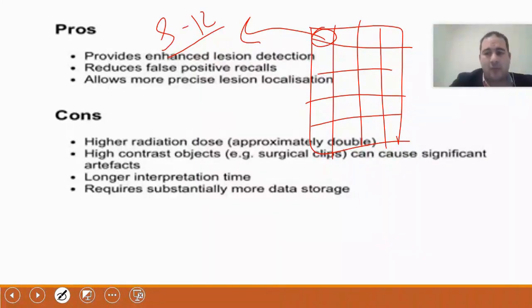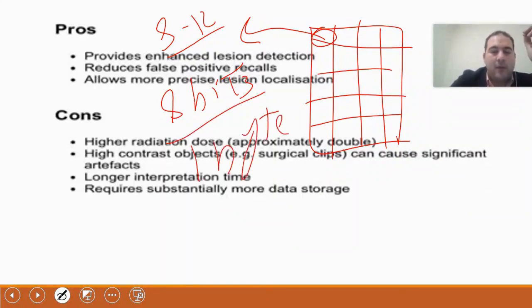Therefore, through the imaging process, I need high contrast differentiation, which means I want a high bit number. Let's assume I have 8 bits. This means that 1 byte corresponds to 8 bits. For example, if I have a storage capacity of several gigabytes or terabytes, this indeed comes from the fact that every 8 bits is considered 1 byte.